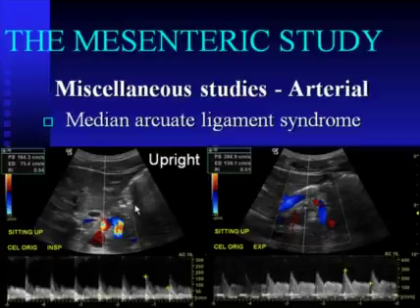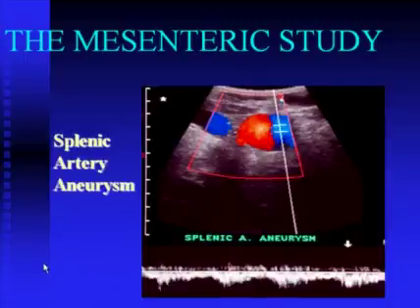In the upright position, gravity will help pull the liver and the spleen down away from the diaphragm further into the abdomen. It will help pull that celiac trunk further away from the median arcuate ligament and relieve some of that compression syndrome. So anytime you suspect that, have the patient tested supine, sit them upright, and look at the extreme ends of the respiratory cycle, inspiration and exhalation.